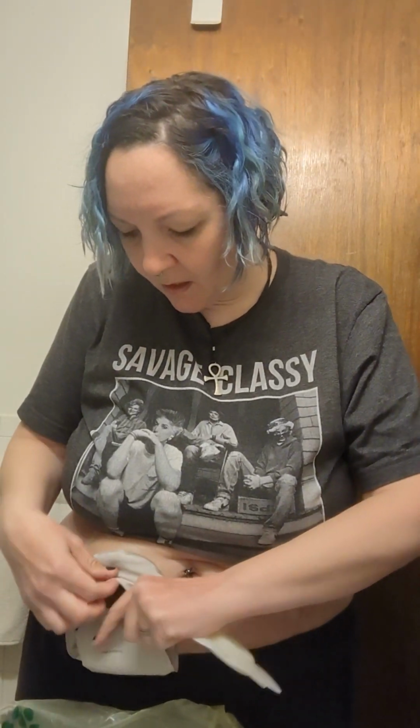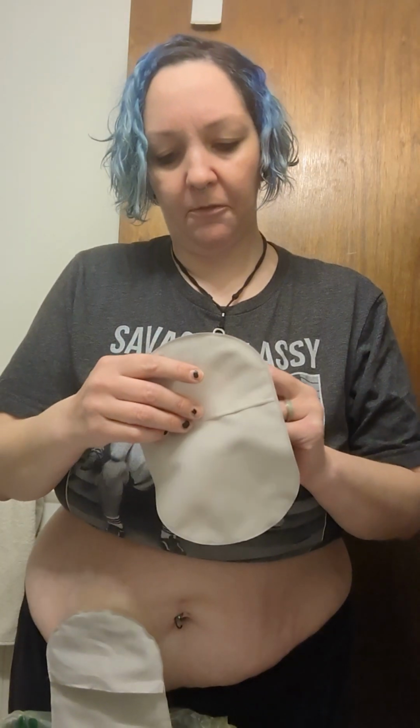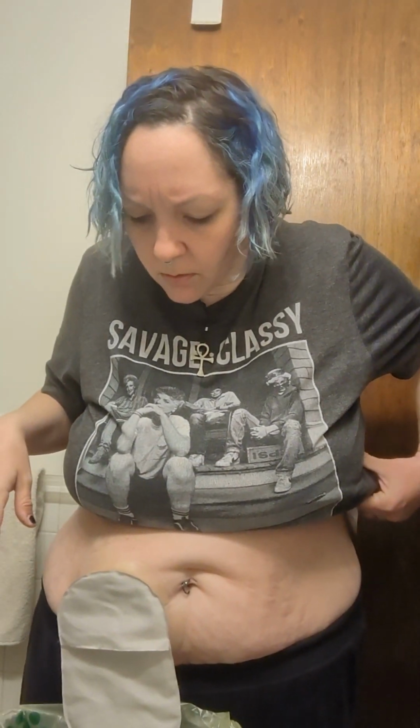Love it, right? So, Moira's a little bit active, that's her name. And, yeah, I don't really fully trust her right now. So I apologize in advance if she says anything you weren't hoping to. In order for these to properly adhere to your skin, you need it to be warm. I legit just stick it. Some people stick it in their pants. I don't know how. I haven't figured that out. So that's what it is.